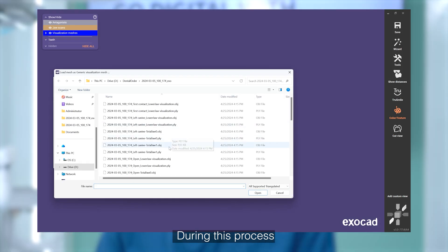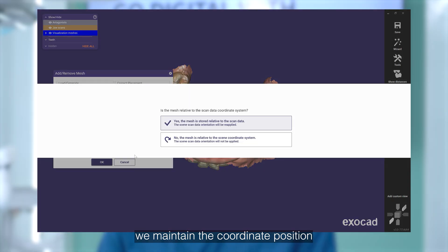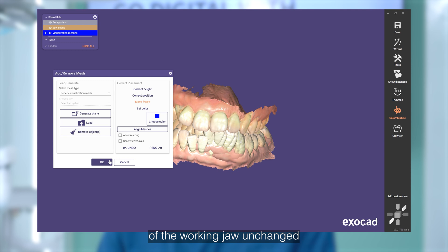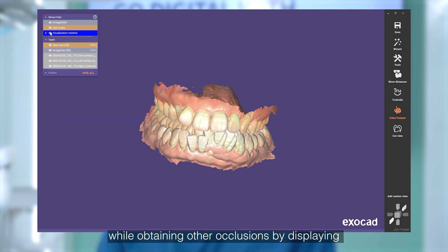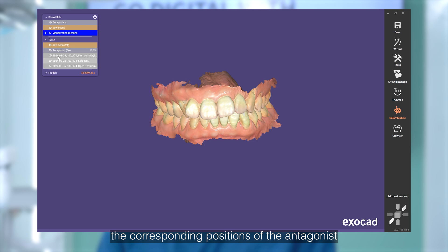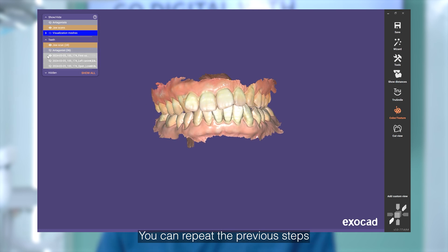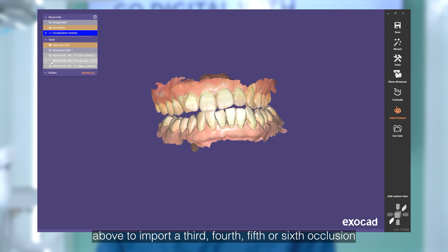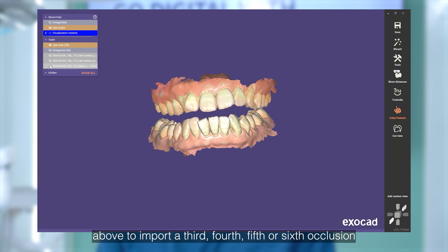During this process, we will maintain the coordinate position of the working jaw unchanged while obtaining other occlusions by displaying the corresponding positions of the antagonist. You can repeat the previous steps to import a third, fourth, fifth, or sixth occlusion.